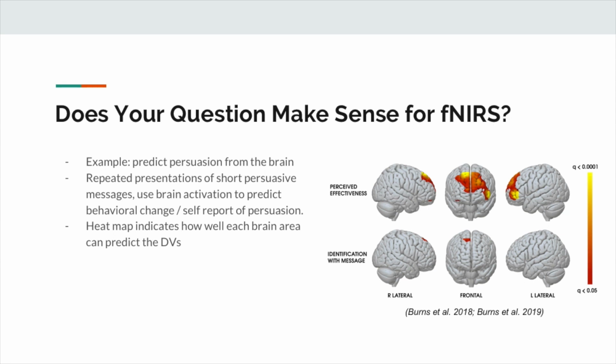That being said, external landmarks, of course, don't correspond perfectly to internal landmarks, and even internal landmarks, as we know in MRI analysis, people's brains can be shaped all funky. So that's again an assumption we make, and we wrap that into the spatial resolution qualification of fNIRS, that we're recording activity from this point in the head. It might have been moved around a little bit on people's heads. So if this is overlaid on a very specific gyrus, I'm not going to say it's absolutely that gyrus. It's this more fuzzy location over that.